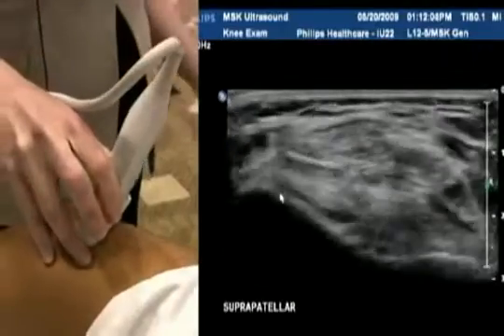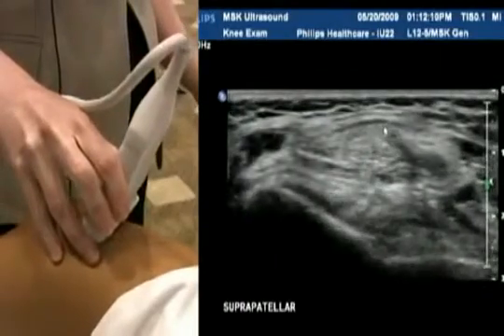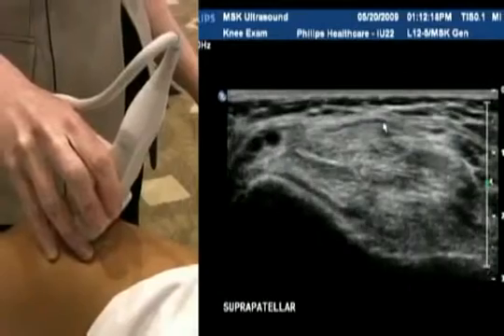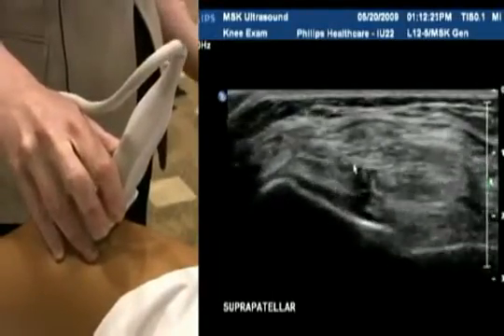We go down to a transverse section now, watching the quadriceps tendon here. It's quite a wide tendon side to side, so that's why the linear 12 is a good choice because it's got such a wide face. You can see here this is the tendon in its entirety — it looks nice and homogenous, quite an echogenic tendon.